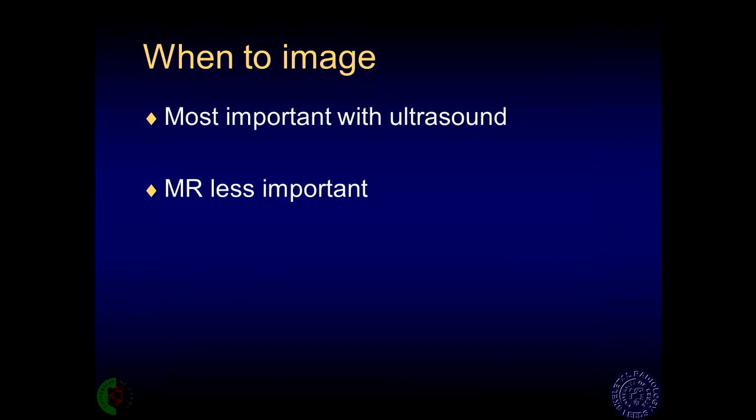So, when to image? Well, that's not too important with MRI. You can image fairly early. We've imaged tears at less than an hour with no problem whatsoever. The hematoma forms very quickly and really gives you a good idea about how severe the tear is.